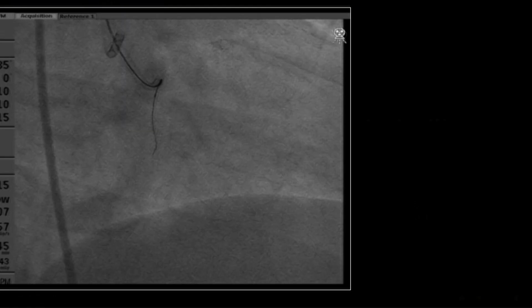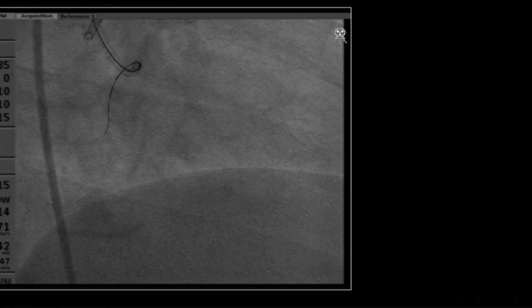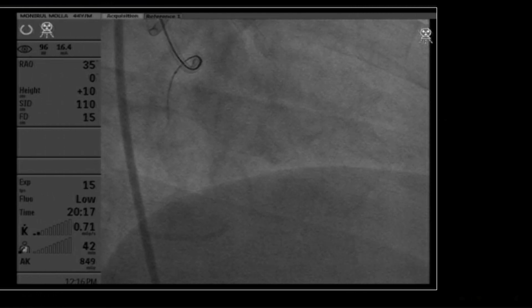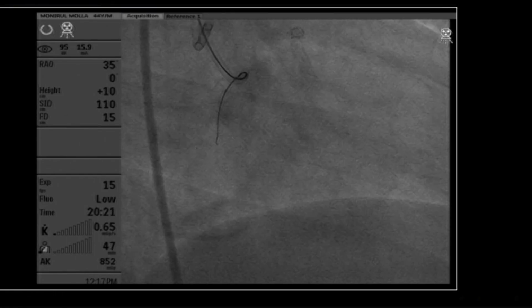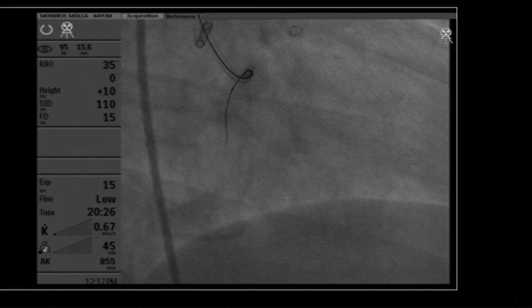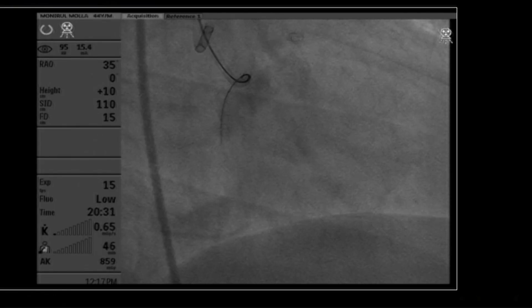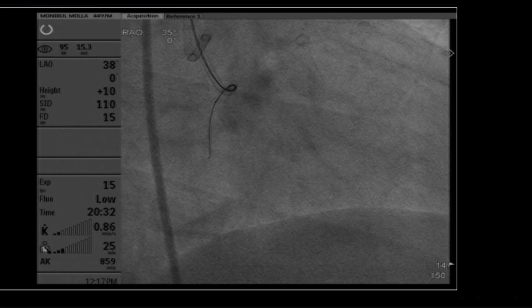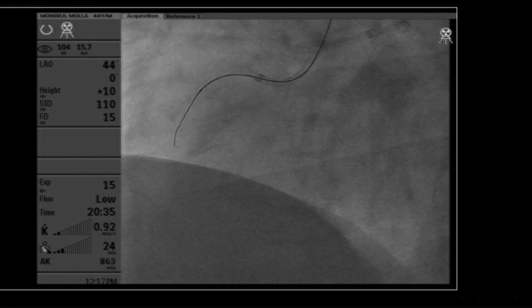Actually, I need a tougher wire here. It is not penetrating the distal cap. I am very close to the distal cap. The proximal cap was easily crossed, but the distal cap is having a tough time, and moreover, it is taking a difficult angulation. Dr. Goel, could you take the microcatheter down or not? It is not going down. My guiding is backing out. LAO back. At this stage, if I could advance my microcatheter, it would be very good.